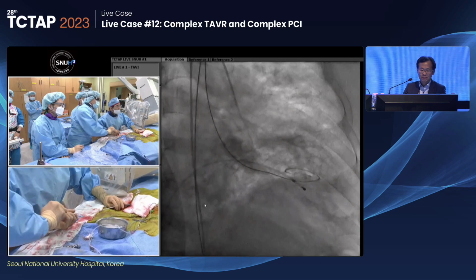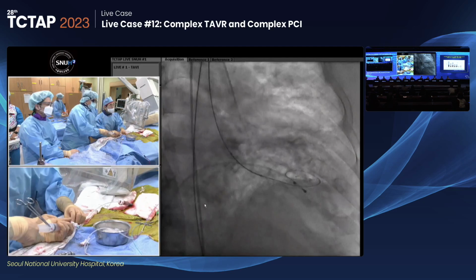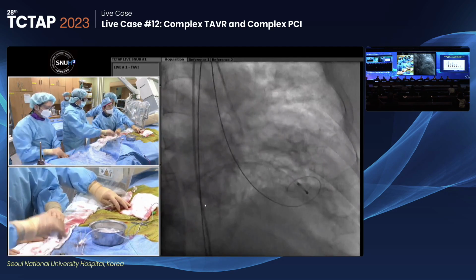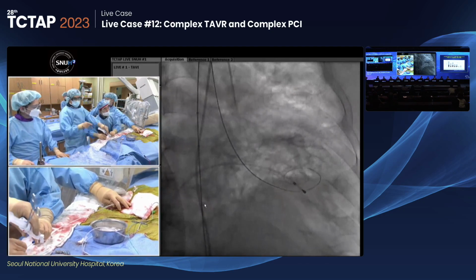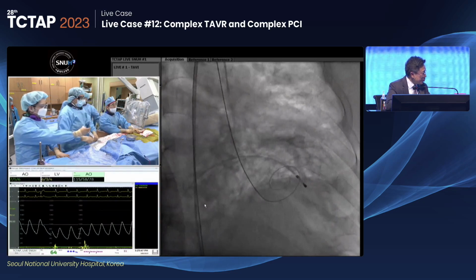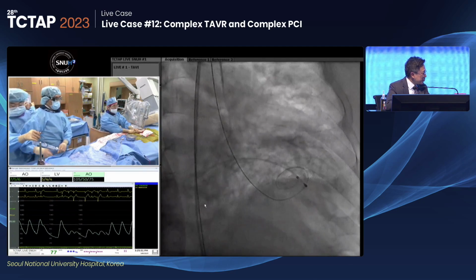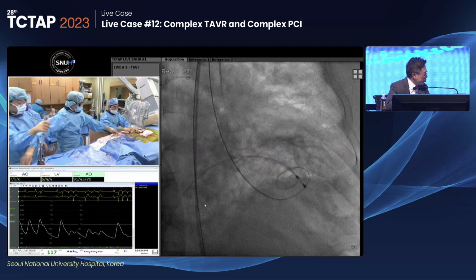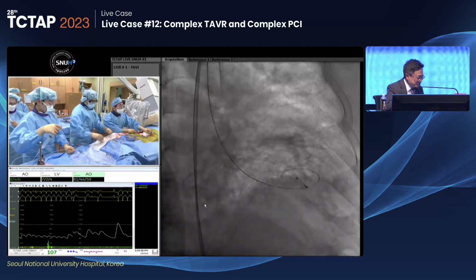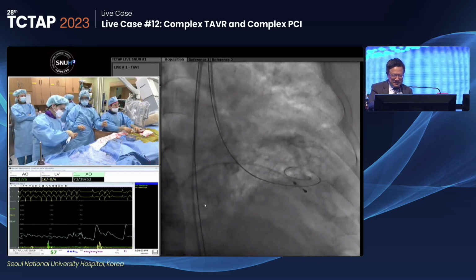You know, the question really is when you have two self-expanding valves, do you need two valves, three valves, four valves? I think the procedure is pretty standard in terms of steps, but each valve has its own nuance. And if you have not done enough of it and you forget, then you get in trouble. For me, I can only deal with two valves. Three is getting a little hard for me. Four, forget it. How about James and the Northwestern experience with another valve like Accurate Neo 2?